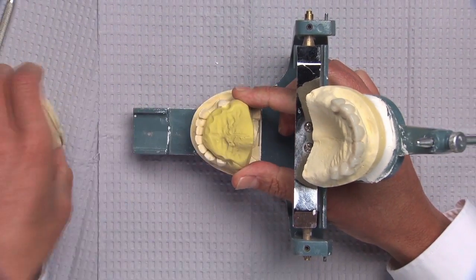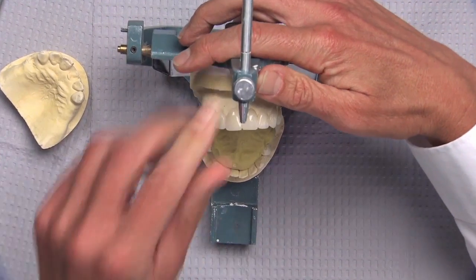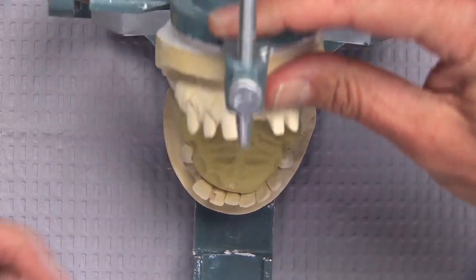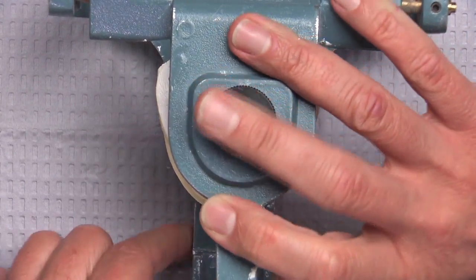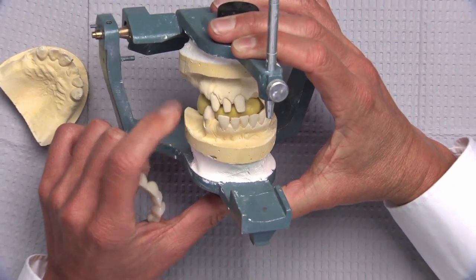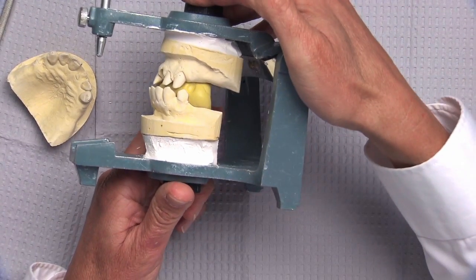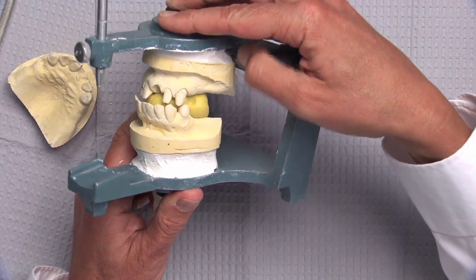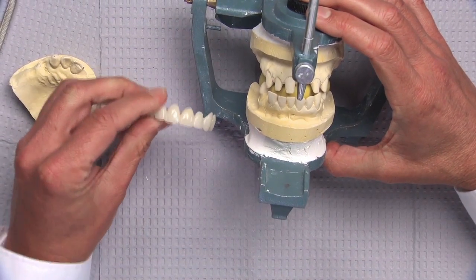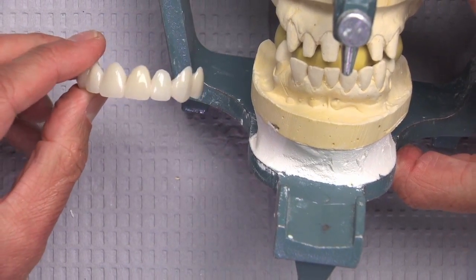What that allows us to do is when we actually do our bio temps — you can see here the bio temps are already prepped and on the model — we want to be able to transfer that bite relationship to what we're doing with the bio temp models. At this point you can see that we're closed down onto that putty because we've prepped all the teeth now, so even if we had good anterior stops, we've now lost them by preparing the model for the bio temps itself. The bio temp has been made as a one unit, and that's what I would do for a case like this.